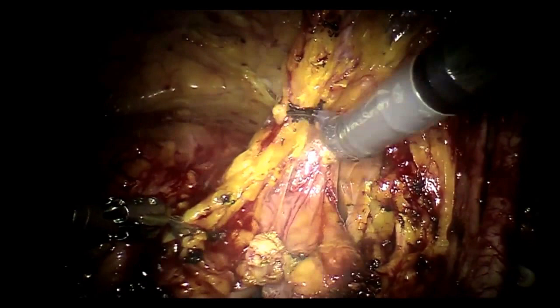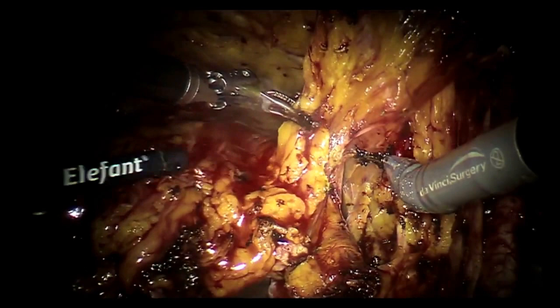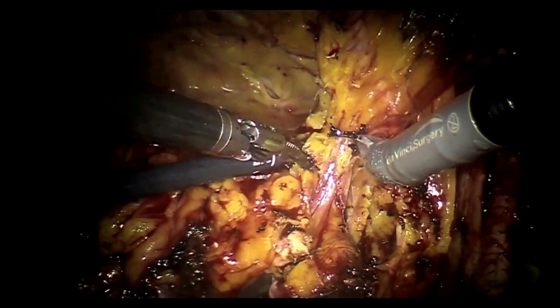Everything is oozing, huh? Yes. I'm using so much electrocautery, but still oozing. Renal failure.